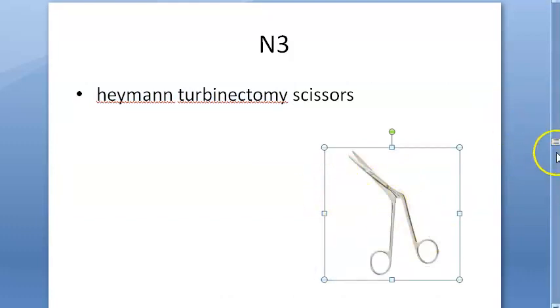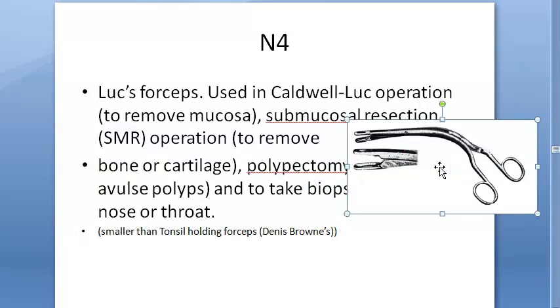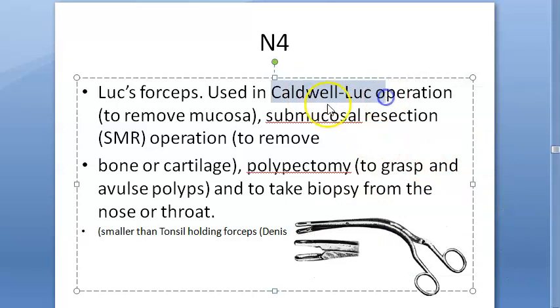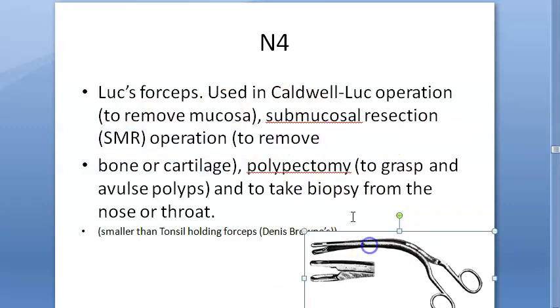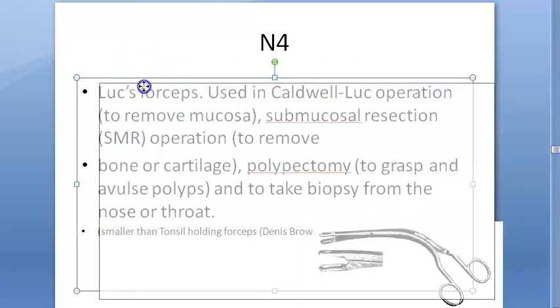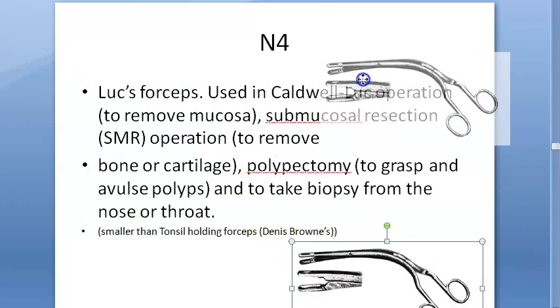Then you have Heyman's turbinectomy scissors, used to cut the turbinates. Next, Luc's forceps — this looks similar to the Denis Browne tonsil holding forceps but is a little smaller. Luc's forceps are used in the Caldwell-Luc operation, for submucosal resection, to remove bone and cartilage, for polypectomy to grasp and avulse polyps, and to take biopsies. Don't confuse it with the Denis Browne tonsil holding forceps.